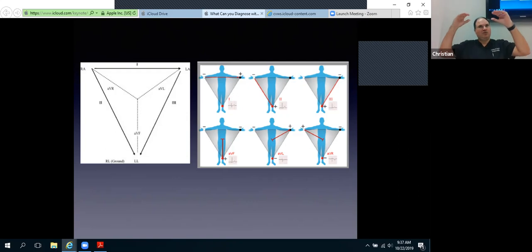And the 2 rooms upstairs are much smaller than the 2 rooms downstairs. And the left room's bigger, right? So we're walking around a heart from different perspectives, looking to see which room there is a fire burning in. And that's what we're trying to identify.